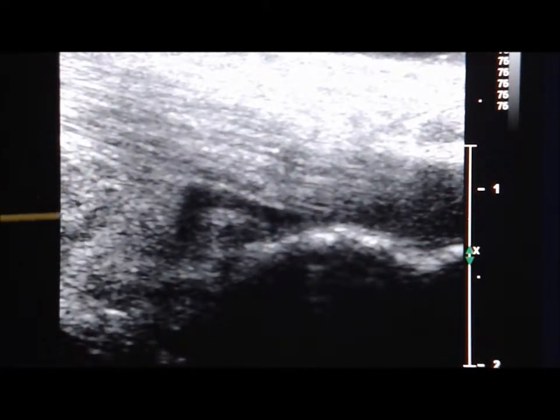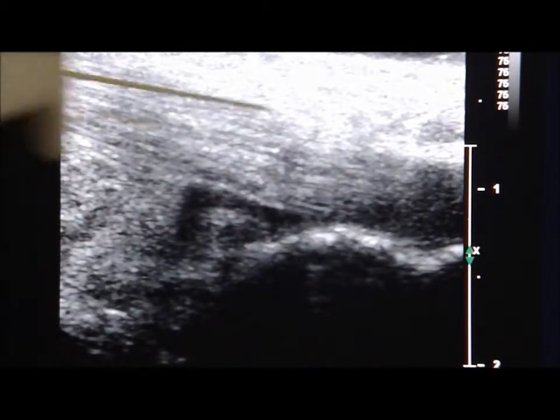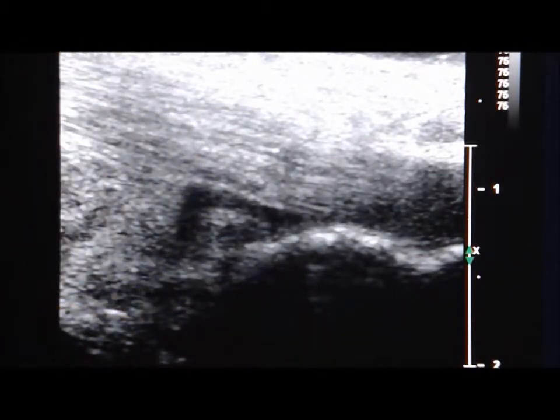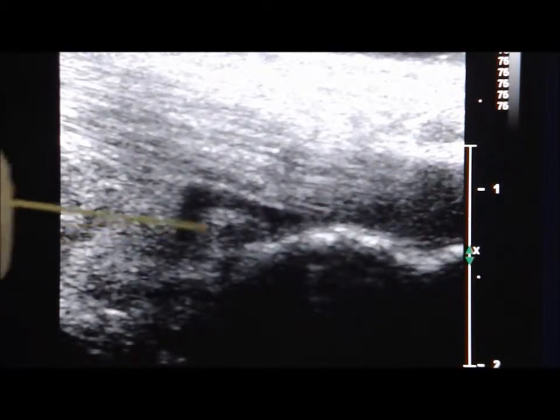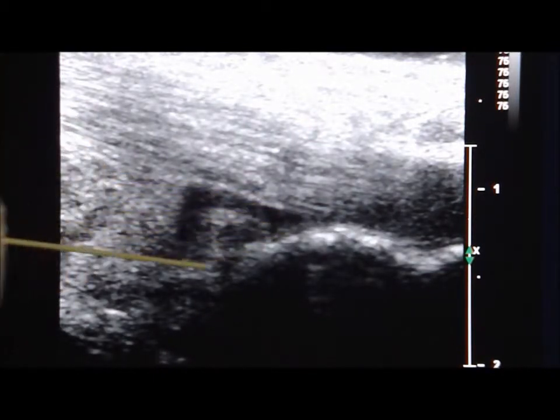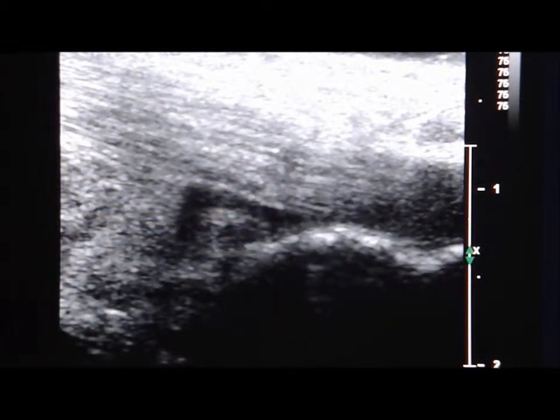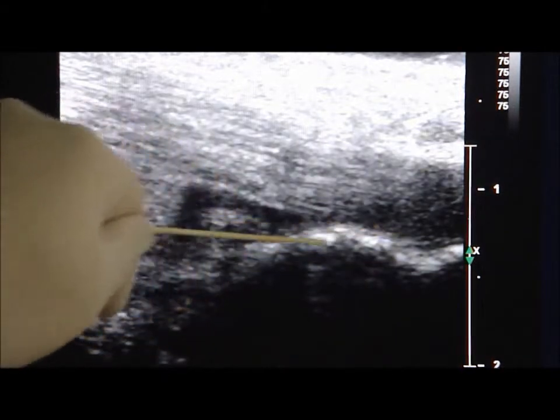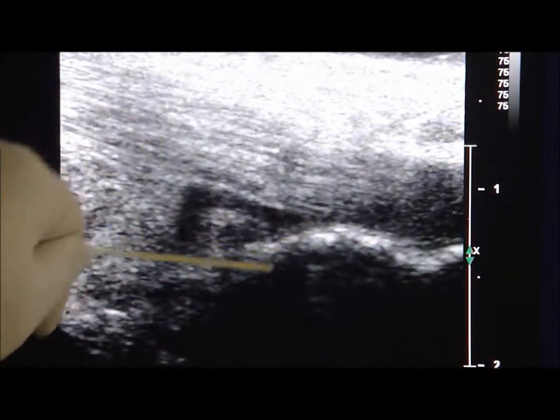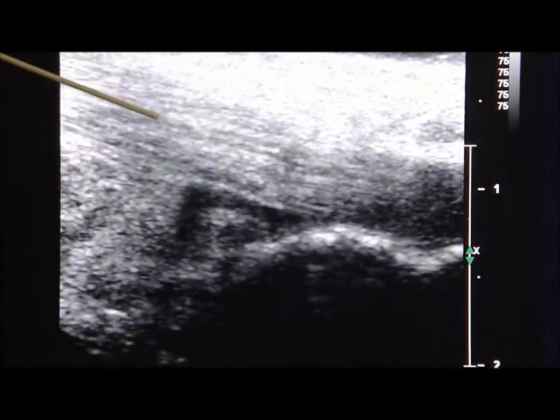This is the sagittal sonographic view of the retrocalcuneal bursa. As you can see here, the bursa is enlarged and is located between the calcaneus and the Achilles tendon.